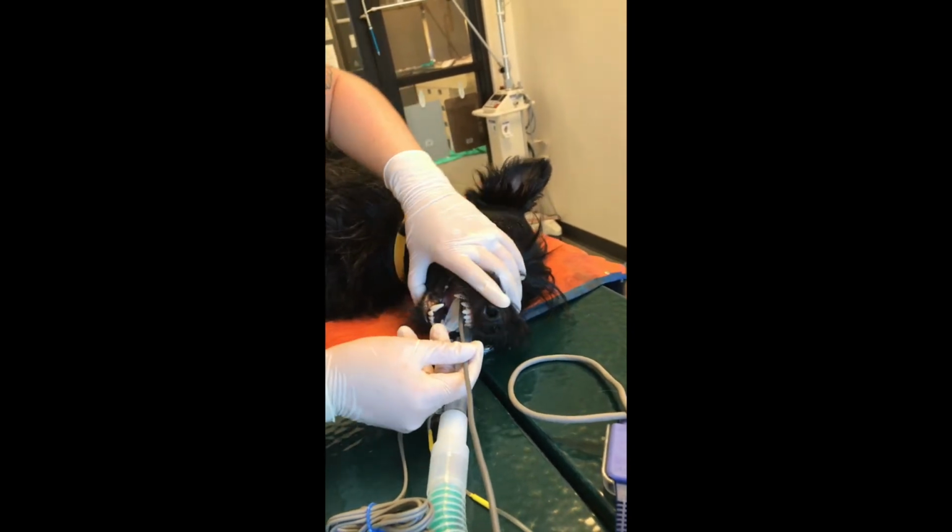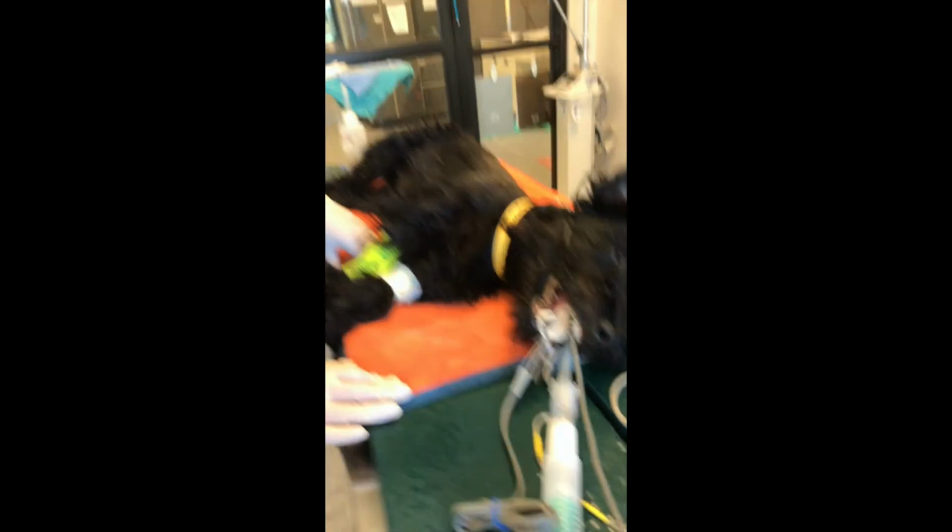And that's it. And all of his monitoring should be picking up there after it stabilizes.